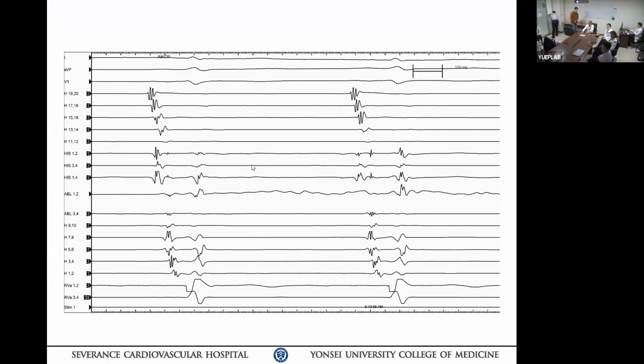Okay, let's take a look. This is an AVNRT case from yesterday. As you can see, this is when we started ablation.